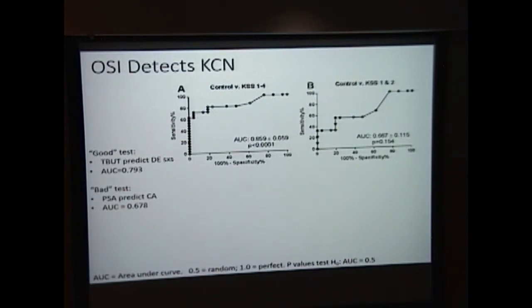Right. In the rare instances where we have nonverbal patients, this would be an excellent way to measure their visual acuity. But I will say that you get on a slippery slope when you want to do this for every single patient who's able to tell you that their vision is terrible. I think it's more useful for clinical studies.